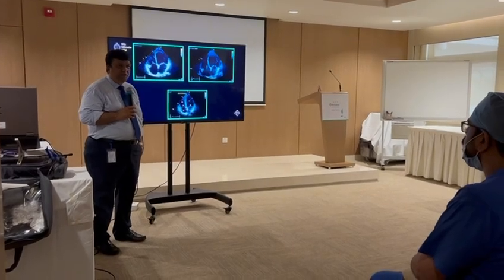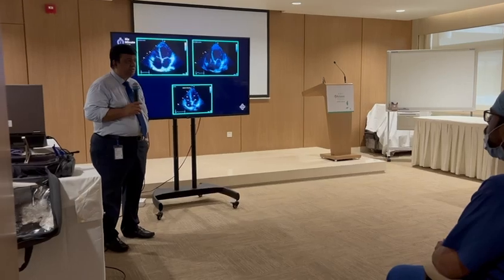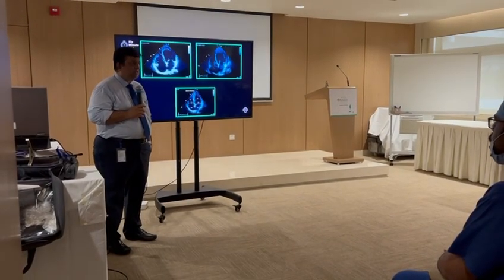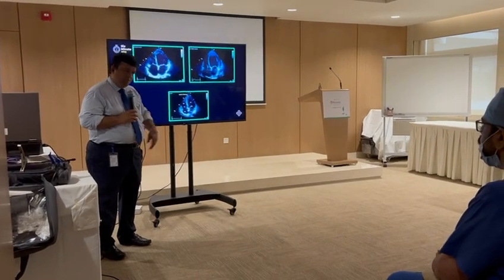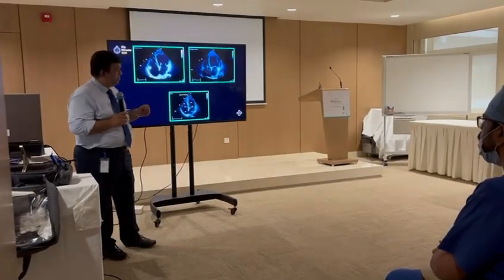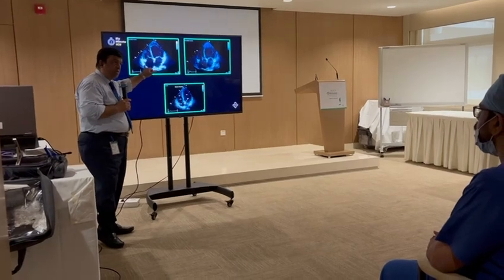So generally speaking, anything less than 25% or 30% we say is poor. Between 30 and 45-50% we say is moderate. And anything above 45-50% we say is normal. So there is a bit of overlap, 5% overlap here and there, and it's acceptable. I would say this is erring more towards poor than moderate.